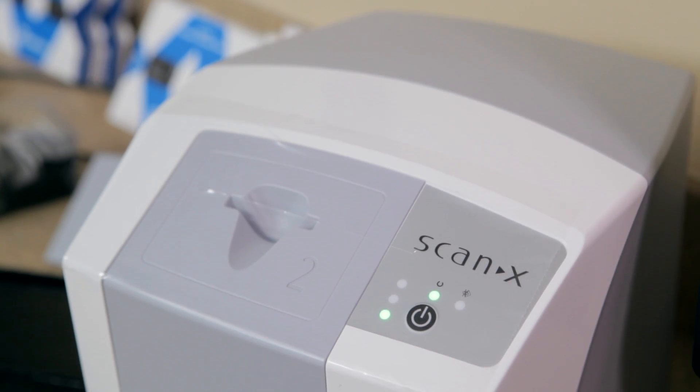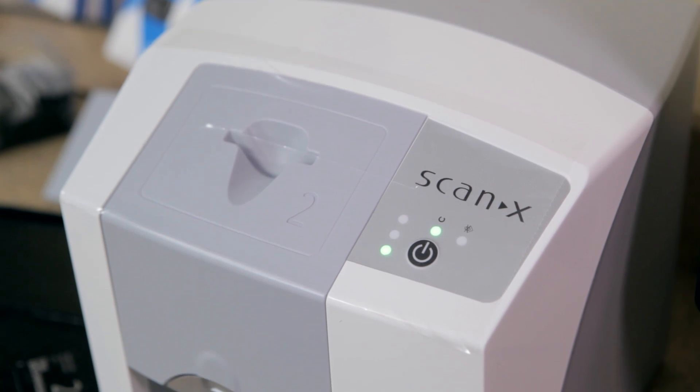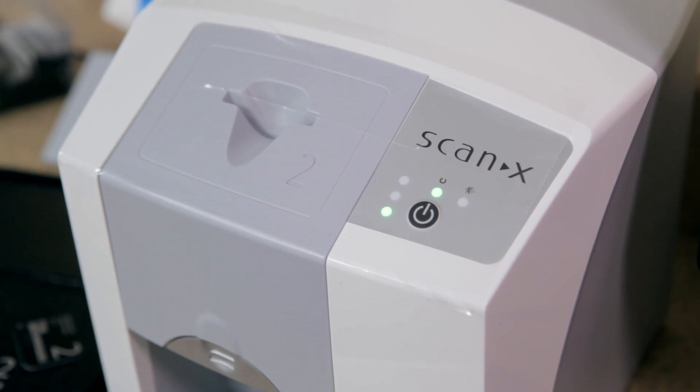Swift. More comfortable for patients. Easy for your team. 100% of the radiographs you want.